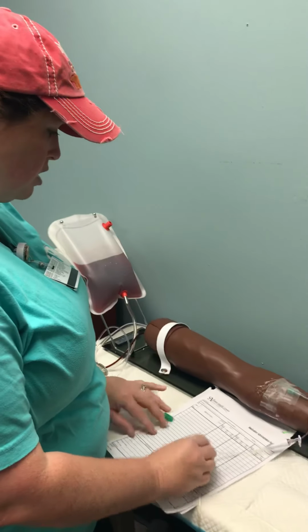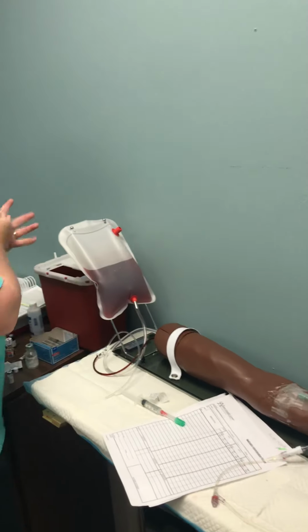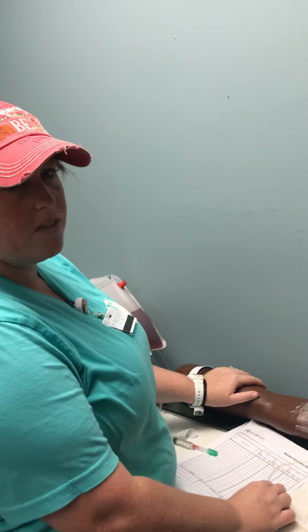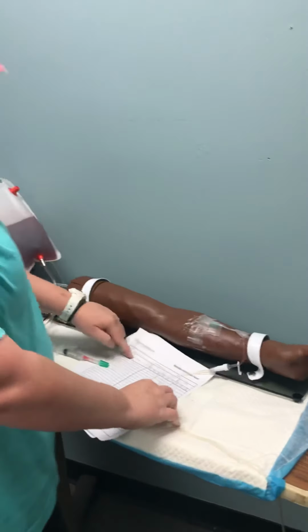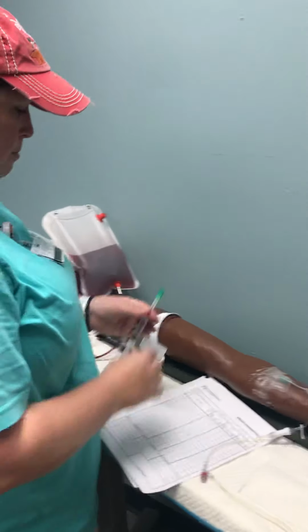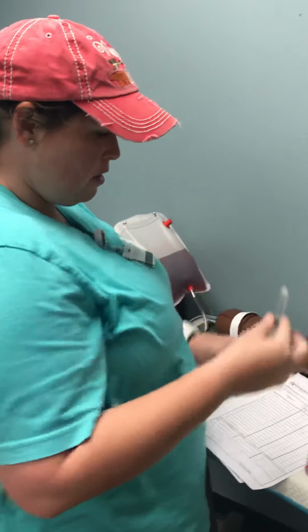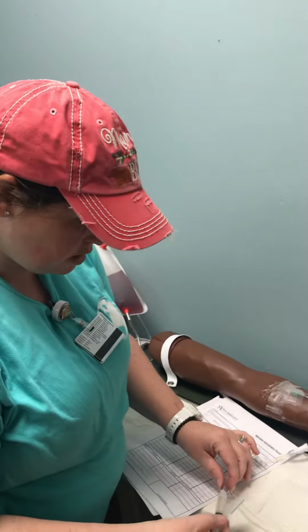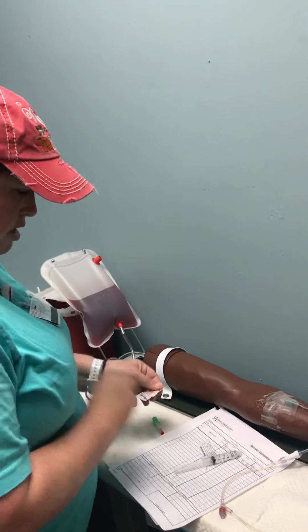And I'm going to wash my hands. Before I give this, I'm going to ask him his name and date of birth, and he tells me his name is John Doe. His birthday is 6/15/2000, and I identify it with his armband and his MAR. So I identify it against that and his MAR. So now we're going to give this medicine. Wash my hands. I need to clean my port.